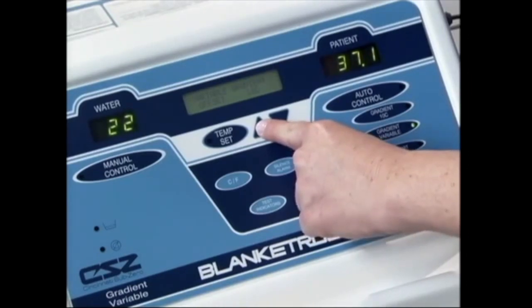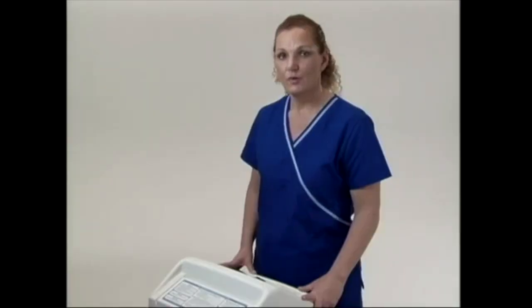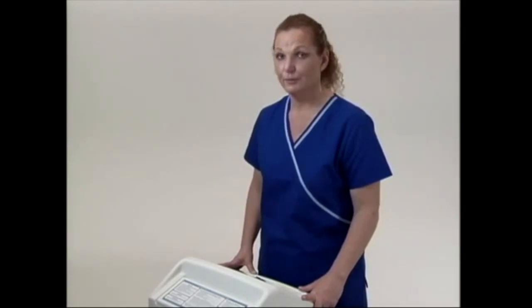Then, to get the water to circulate, press the gradient variable button. The water temperature will be based on your patient's core temperature, plus or minus the gradient variable based on your patient's needs.